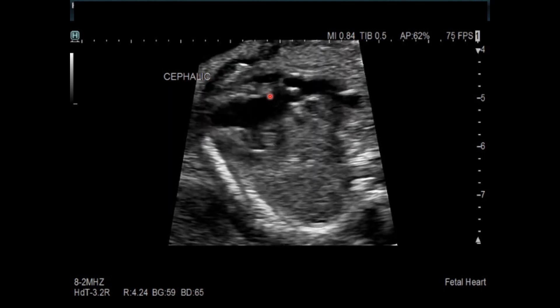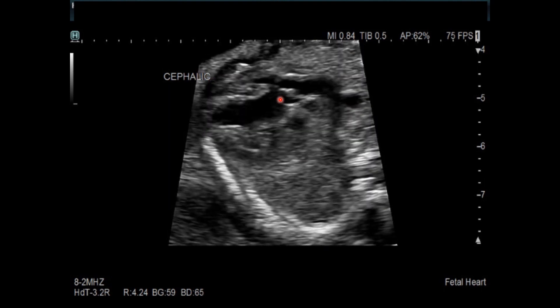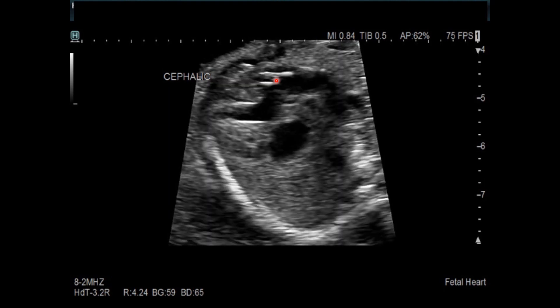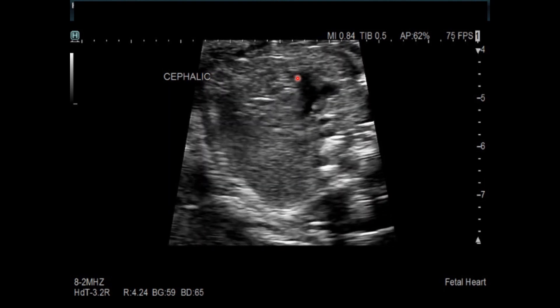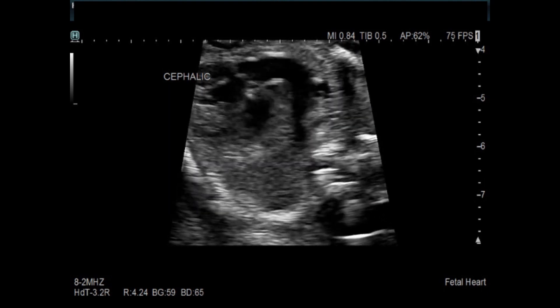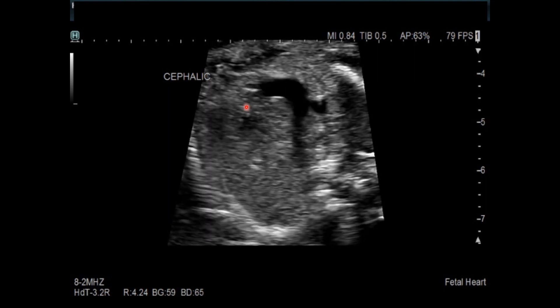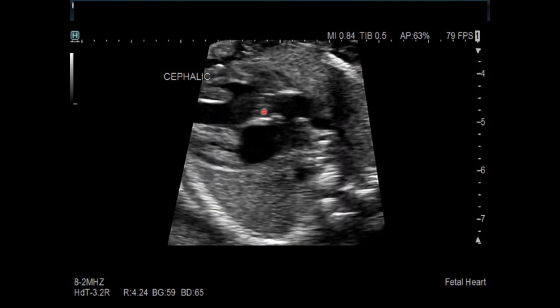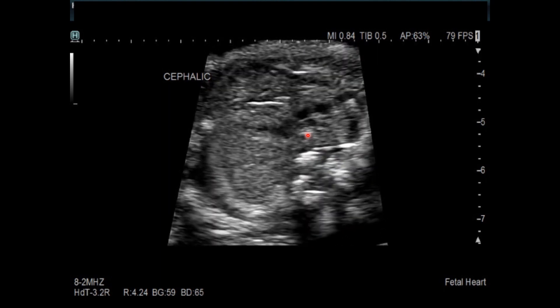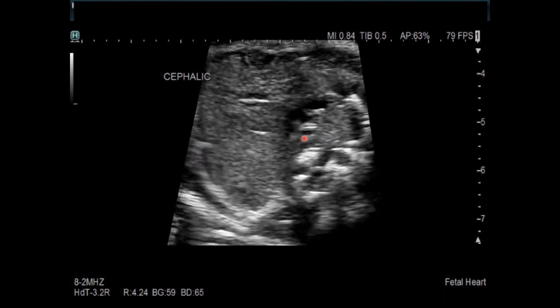Looking more closely at the posterior outflow tract, which we think may be the pulmonary artery because of the bifurcation at the end — a right pulmonary artery and a left pulmonary artery. The valve looks thickened and dysplastic, and the sub-pulmonary region looks narrowed. There is the other outflow tract becoming the aorta, with a nice wide open sub-aortic region. Here is the trachea, and this aorta arches to the left of the trachea.